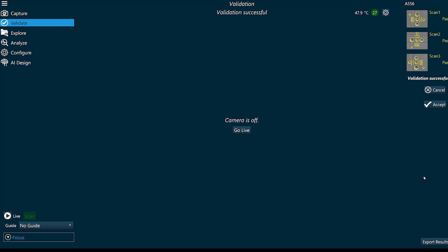These scans are automatically saved to our default directory, but we can also export the results if we need to save them for further traceability information. Now I can click cancel or I can click accept. I'll click accept and then we're ready to use the system.